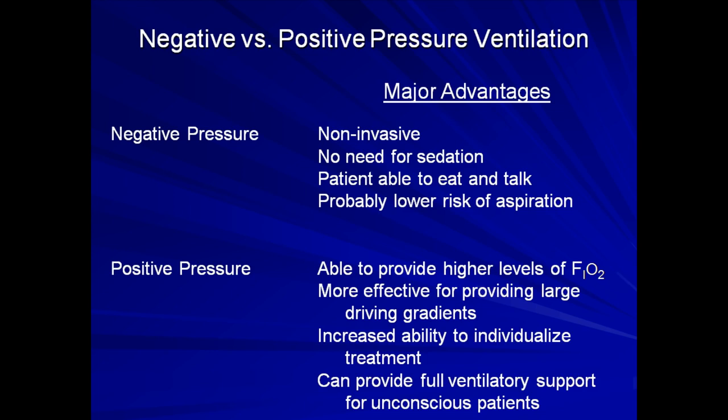Unfortunately, they really only work for patients with neuromuscular disease and its associated hypoventilation. That specific type of respiratory failure makes up a tiny percentage of all patients requiring mechanical ventilation. Therefore, the Port-a-Lung aside, negative pressure ventilators are rarely used in practice today and have been relegated to museum exhibits.